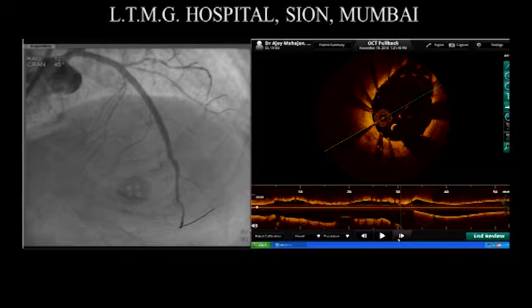Okay. Yeah, so this is the beginning place of the aorta. It is slightly hanging. That is in the aorta. It is the beginning of the aorta where it is at the 12 o'clock, 1 o'clock. It is hanging. Now there's a good result with regard to left main, of course.